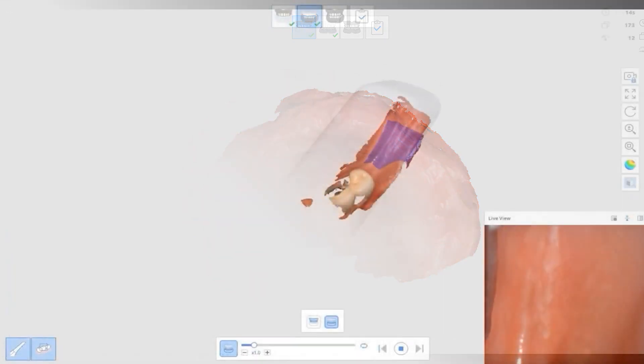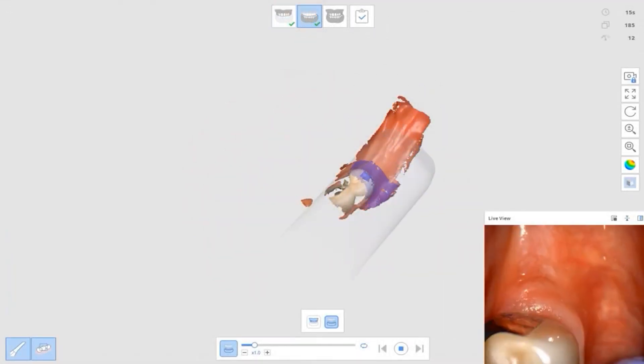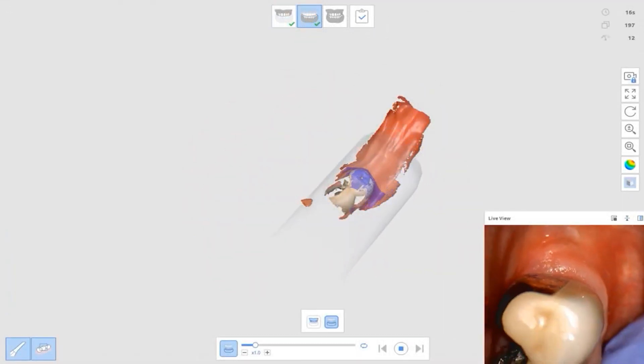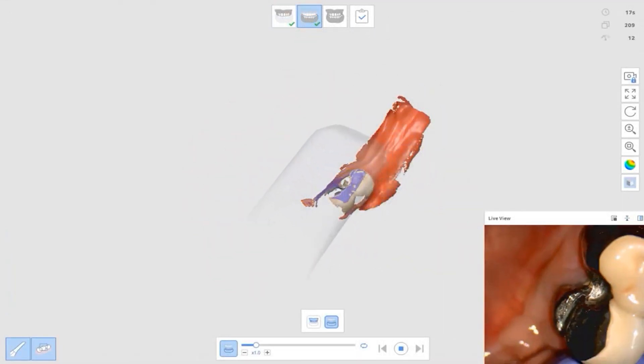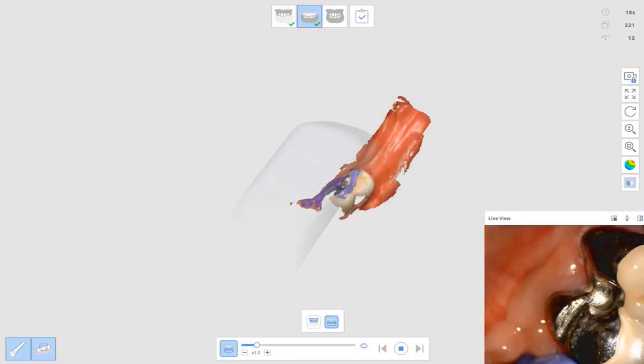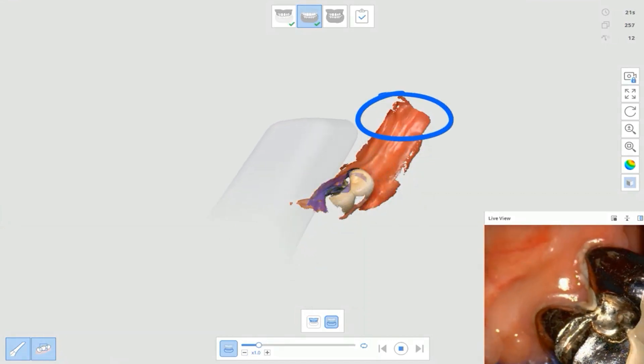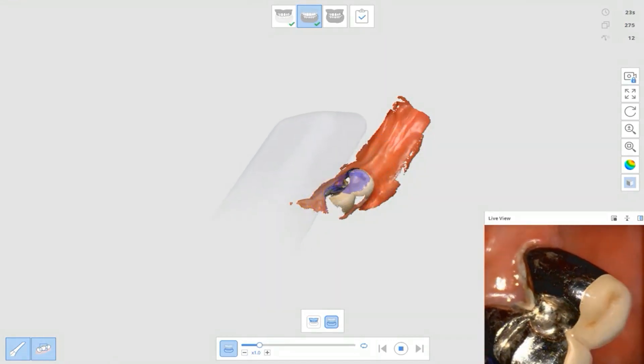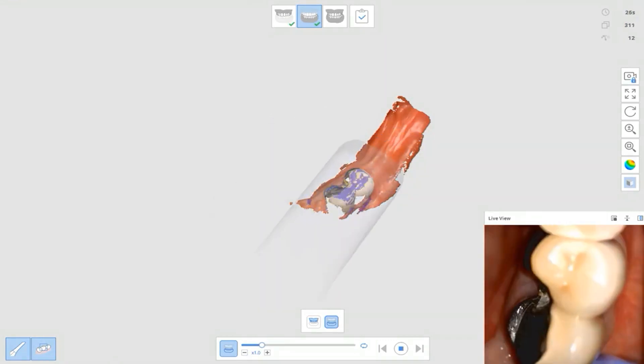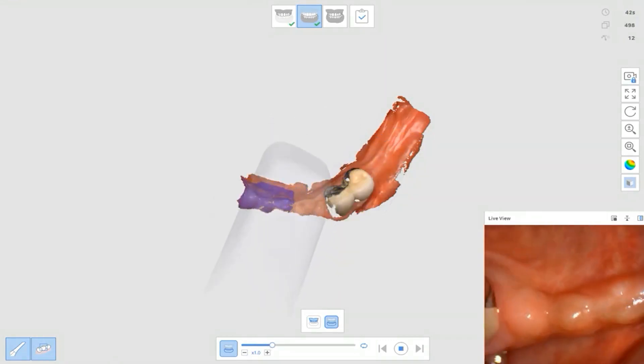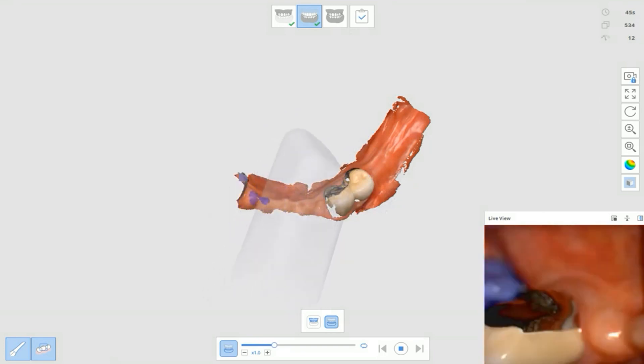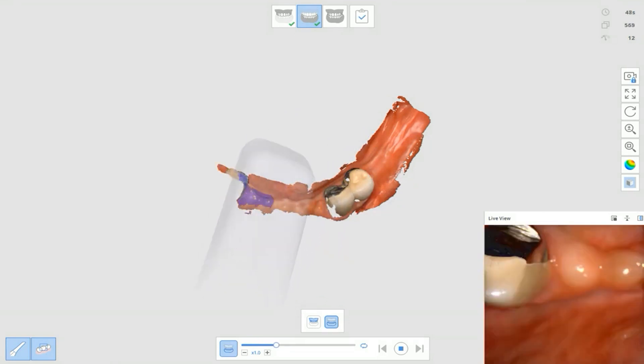The next scan will be the Edentulus mandible. Begin with the retromolar pad. Build up the baseline by scanning the alveolar ridge and reach the opposite side of the retromolar pad.